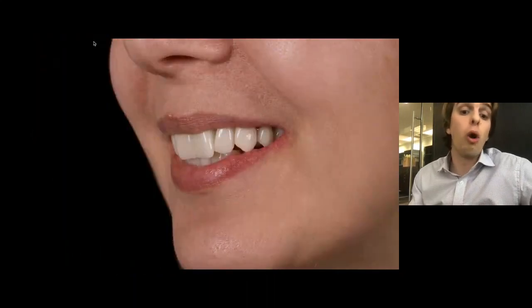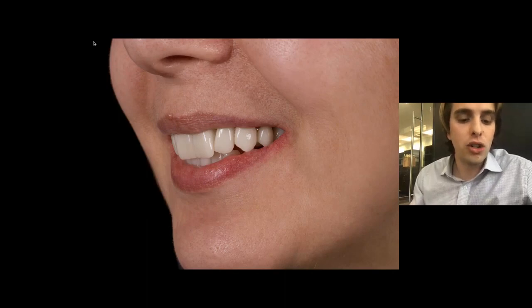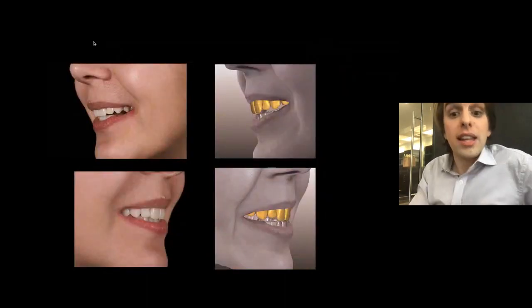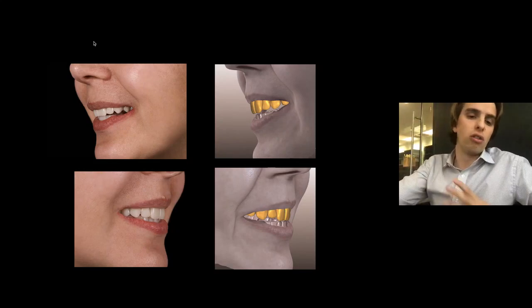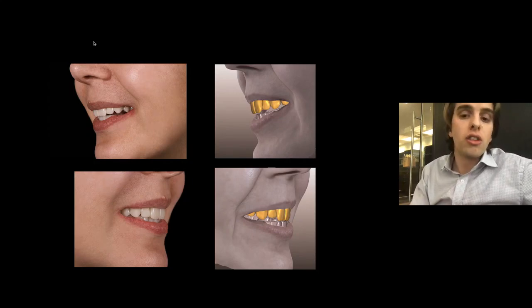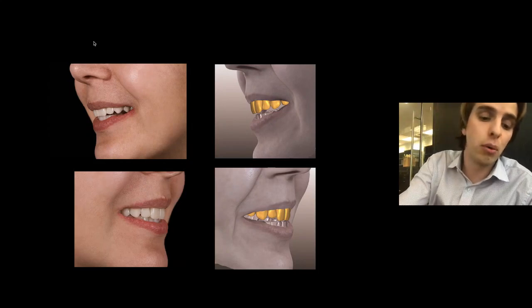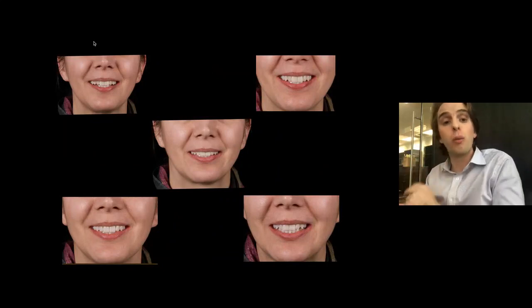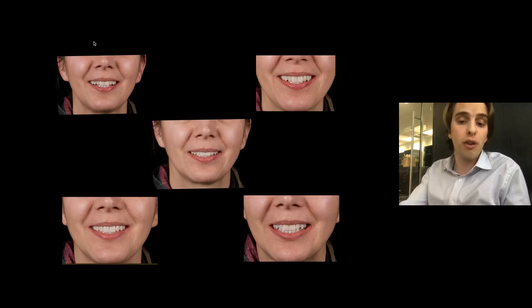What if we shift the laterals back, or what if we open up the central incisors to give them a butterfly effect? And you can see that really the technology is bringing us very, very close to what we are looking for, or what we're getting out on the other side when we mill these structures. So we can start to place a lot of faith in these tools to provide us accurate and predictable results. And at the end, the patient goes home with this ledger of different setup options, and they show their family, and more importantly, their friends, the types of services that the doctor is providing.